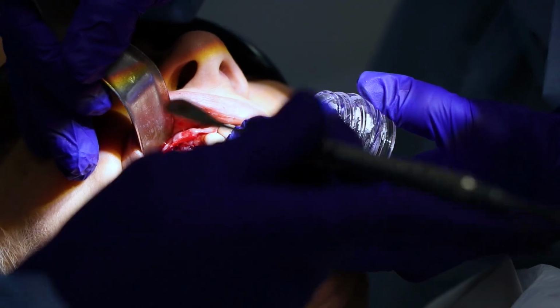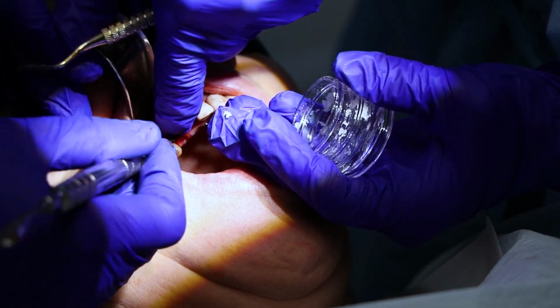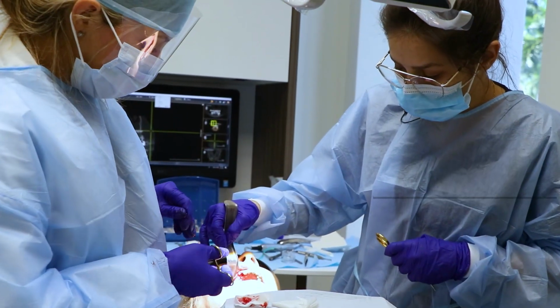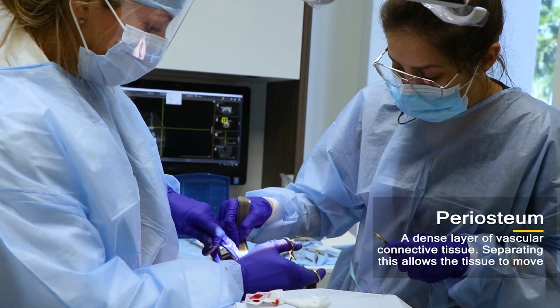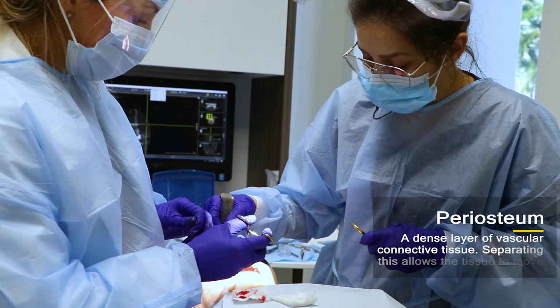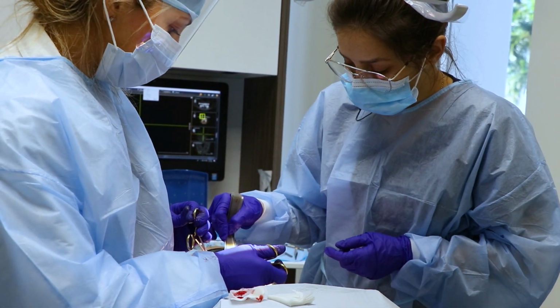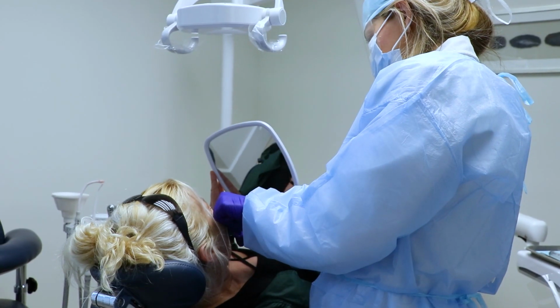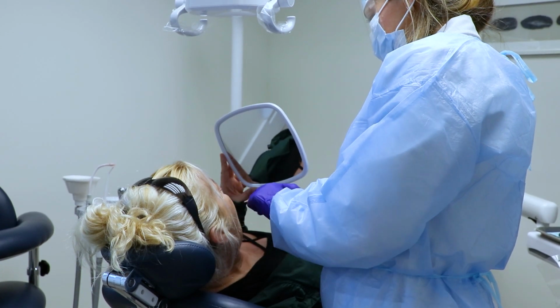In order to get primary closure, the gums need to close completely. So to do that, what I can do is I can just separate a bit of the periosteum, or the inside layer, and that will allow me to get some stretchiness in the tissue. I'm trying to put this in layman's terms, but then I can basically get that primary closure by stretching the muscle or the tissue over the extraction site and sealing it off.